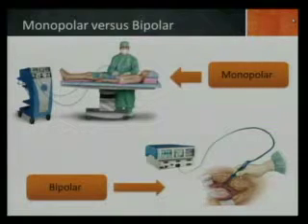We use monopolar, I think, more frequently because you have a really wide range of tissue effects that are possible by altering the waveforms, and the tissue effects are a little bit more powerful. That being said, with bipolar you use 1/3 to 1/10 the amount of power to create the same effect, so bipolar can be safer.